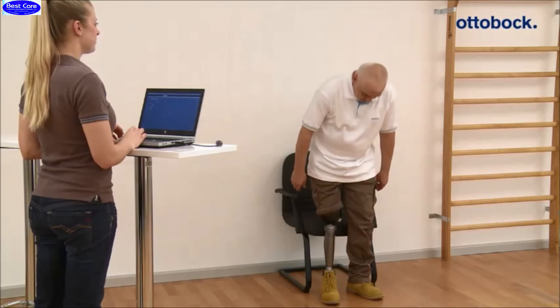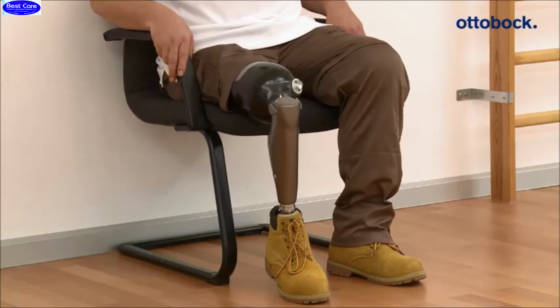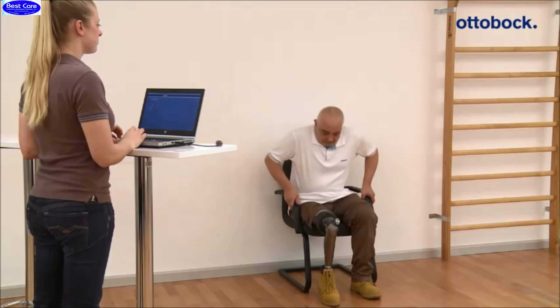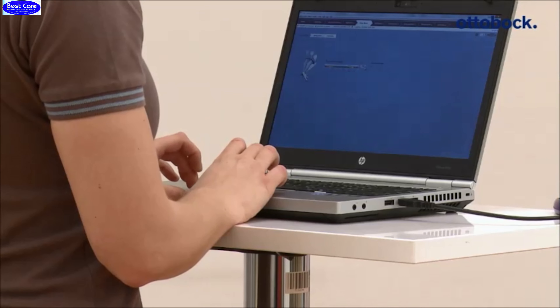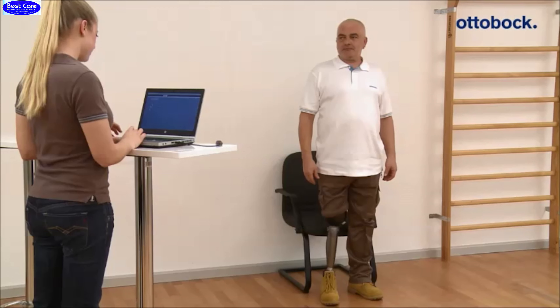First, the adjusted stance flexion resistance is checked while performing a sitting-down movement. The patient should be able to load the prosthesis while sitting down. The flexion velocity should meet the patient's needs and can be adjusted via the adjustment software.